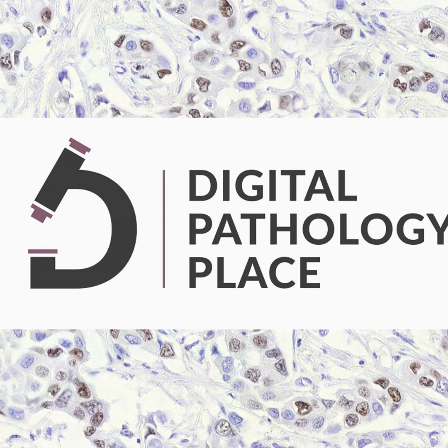In April 2020, the FDA issued an enforcement policy for remote digital pathology devices during the pandemic. This temporary measure allowed for the use of different digital pathology hardware and software, even those not approved or cleared as medical devices, provided that an internal validation was performed at the institution using the devices.